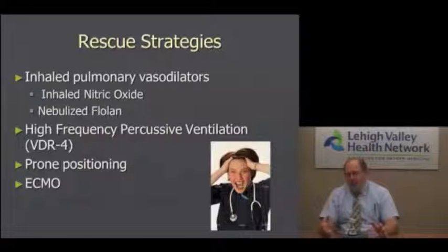And what was really interesting is that the authors, who are very smart individuals and have been utilizing mechanical ventilation all their careers, came up with the conclusion that in certain situations volume ventilation is better, and in certain situations pressure ventilation is better. However, there is no evidence to show that volume ventilation is better than pressure or vice versa. It's really how you apply it to the patient. So just keep in mind that you'll hear a physician say, well, volume ventilation is always better, or pressure ventilation is always better. After 40 years, there is no evidence to show that one is better than the other. The way you apply it to the patient and certain patient etiologies, and we'll talk about that, is the most important, but not one way is better than the other.